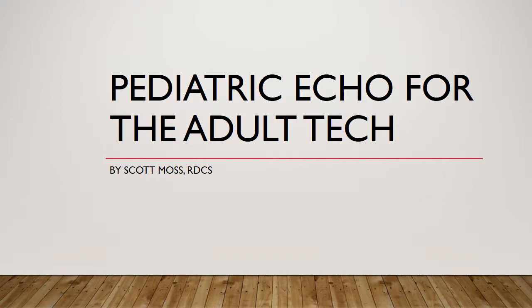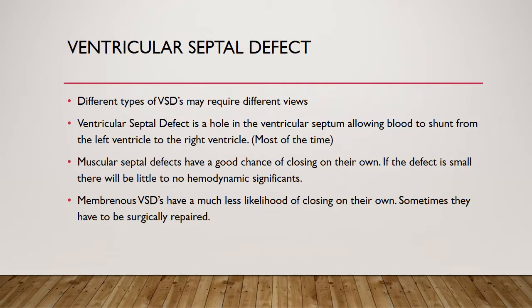Hi everybody, pediatric echo for the adult tech again. I'm Scott Moss, registered in both adult and pediatric echo. I've been doing it 30-plus years, just retired. I wanted to go over VSDs today — ventricular septal defects. There are different types of VSDs that may require different views.